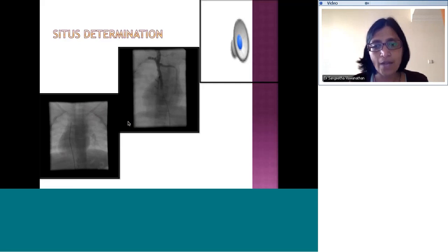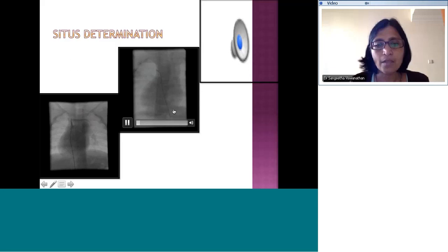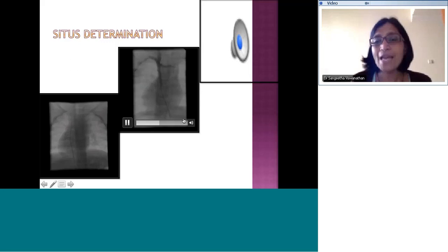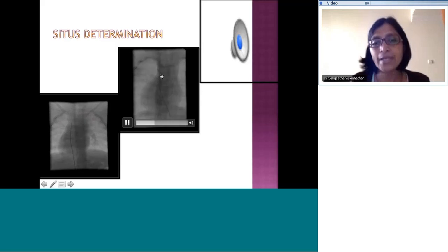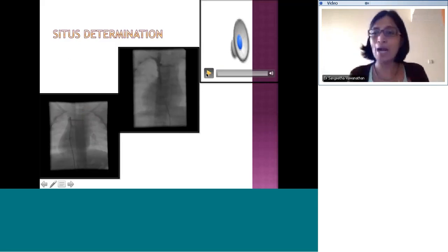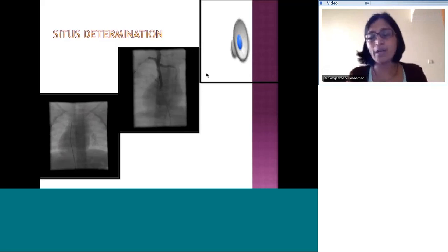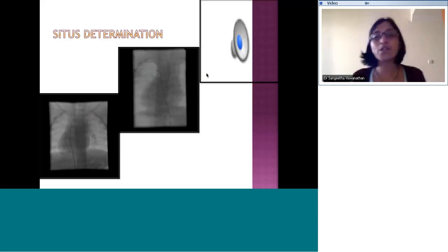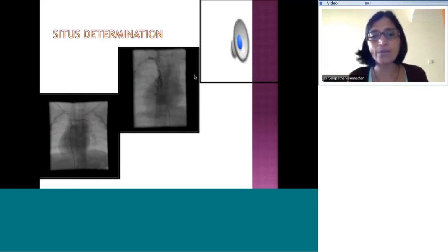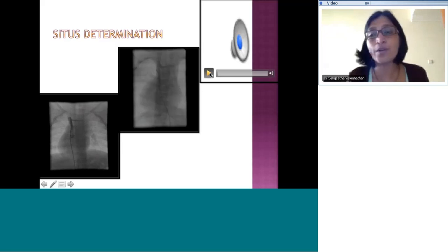This is another angiogram — this patient also has dextrocardia. If you pay attention to the root of the catheter below the diaphragm, the catheter is running to the left of the spine. So this is dextrocardia inversus. The catheter is in the right-sided SVC, and it looks like this patient has bilateral SVCs with a connecting vein in between. The situs appears to be inversus. The best way would be two injections — one in the aorta and one in the IVC — but this information is often obtained by echocardiography.